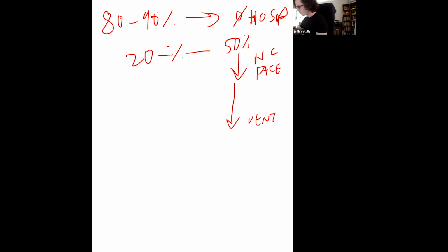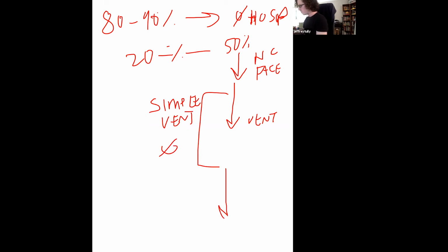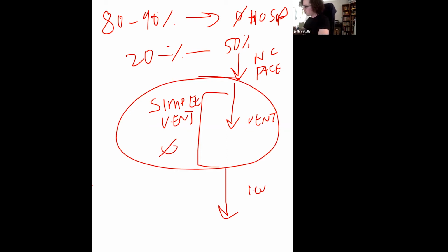There might be a population in here that we can capture who would respond to that simple ventilation without the complex fancy sensors. And then there's going to be a component that's that much sicker and needs to go to the ICU and might die even with the Cadillac ventilators. So I think the best place to target is to work on increasing the supply of people who can receive basic positive pressure ventilation.